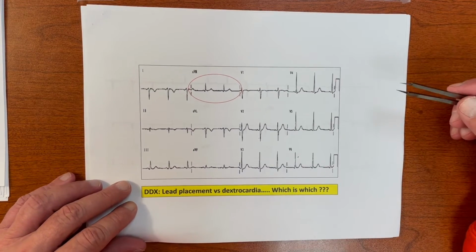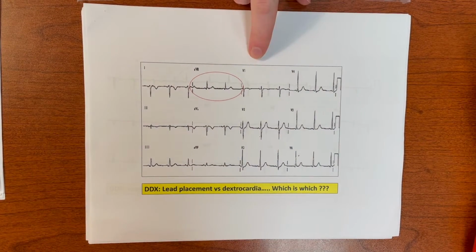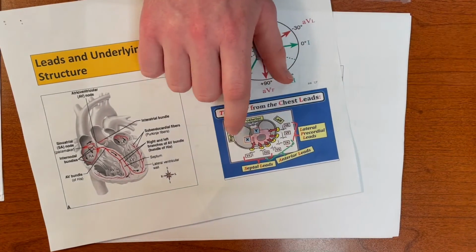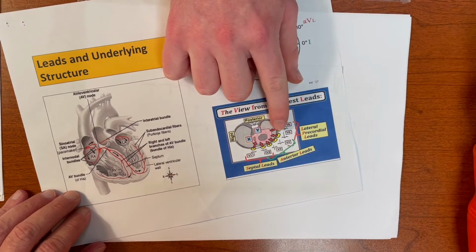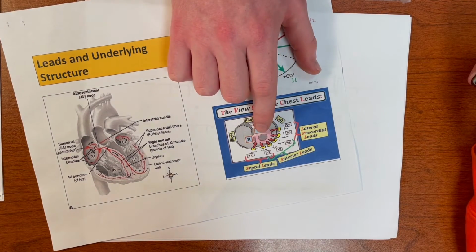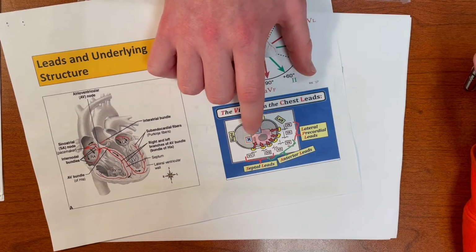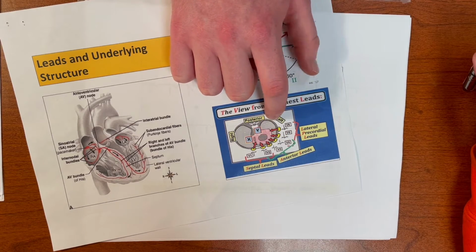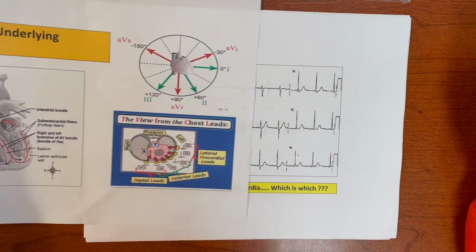Okay. Well, one of the places I would think you could look would be on the precordial leads, because like you said, in dextrocardia, the heart's on the completely opposite side, and so instead of, especially these lateral leads, showing a QRS that's positive as the heart depolarizes towards V5 and V6, the heart's over here, V5 and V6 would have a really negative QRS. Is that right? That's right. Absolutely. So that's just using a very simple tool.